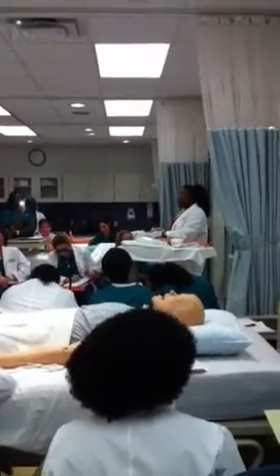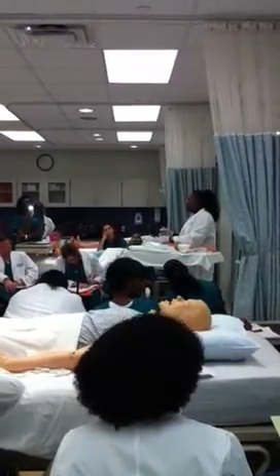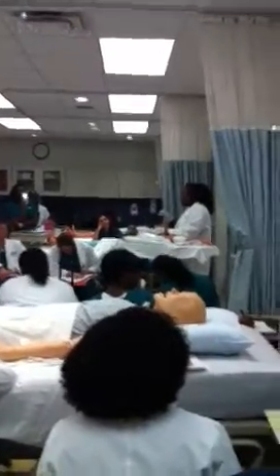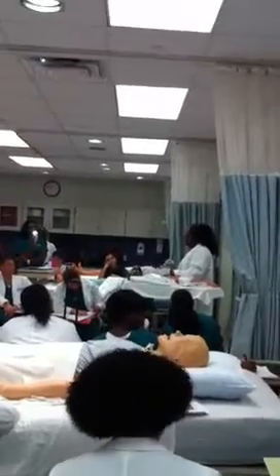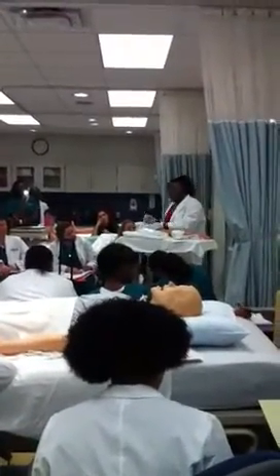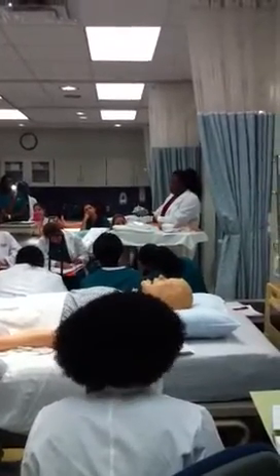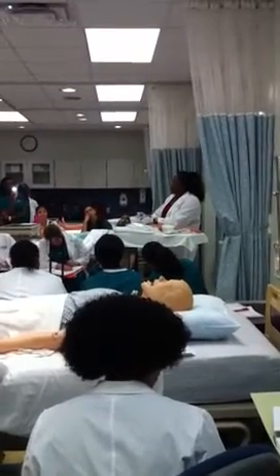Meaning on the test, I need to remember which one is up 45, which one is 90, I'm thinking. But if you think of all of them as 90, then there's no reason for that, right? Practice utilizing 90. I'll give you a little clue to help you remember. Make life easy. 90 degree. Pinch, right? Go in. Push your medicine in.